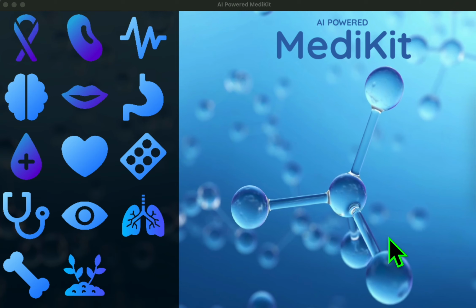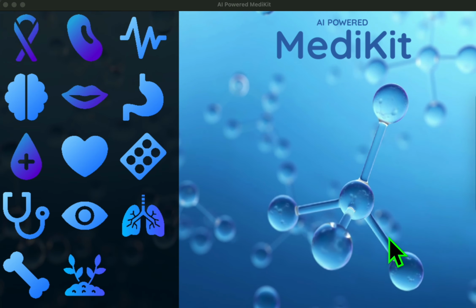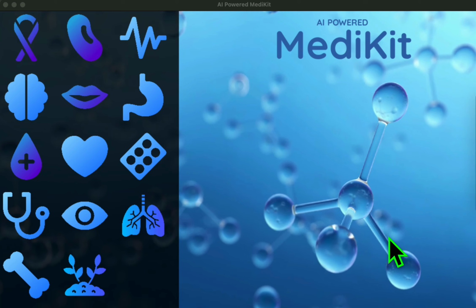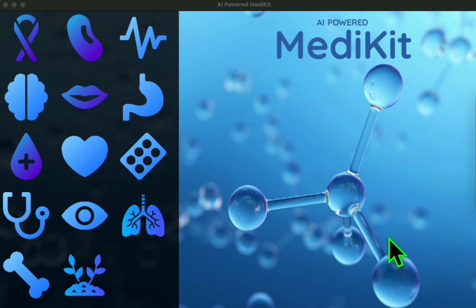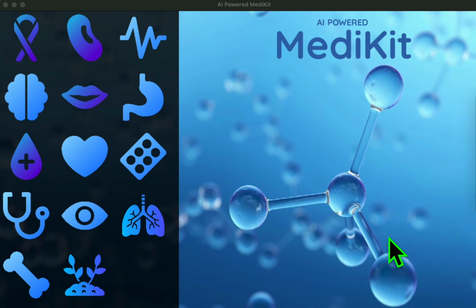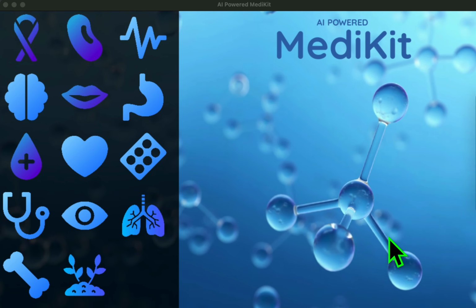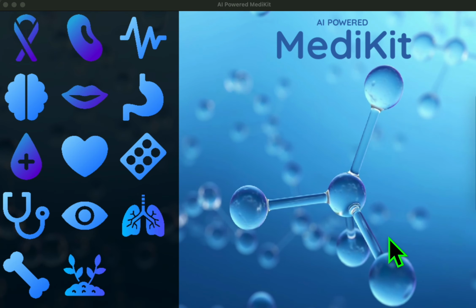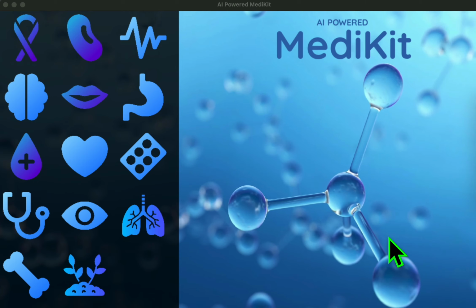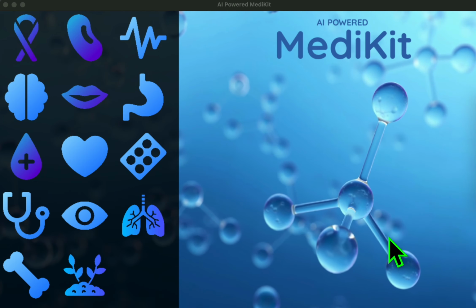So inside this AI powered medikit, we have incorporated classification using ViT transformer and its advanced state of the art self-attention mechanism rather than relying on convolutions. And we have also incorporated some MFCC based classification for heartbeat analysis. And for tablets, it is a few shot classification, not a normal classification. We can classify more tablets. Yes, and we have this herbal solution. This is a text similarity search actually.